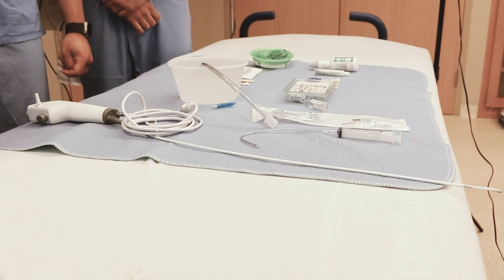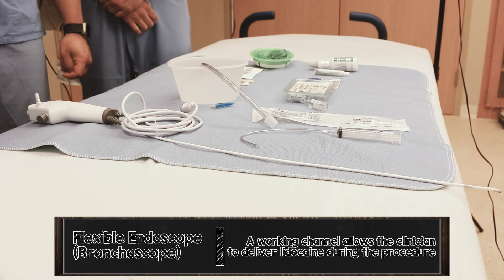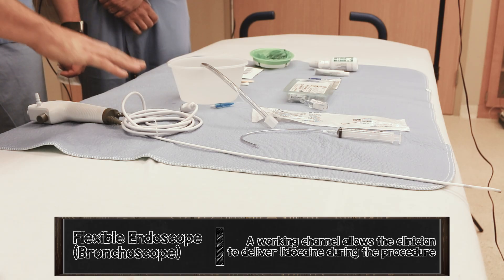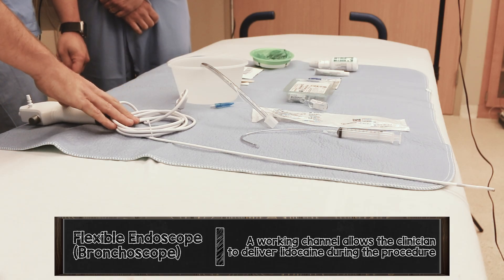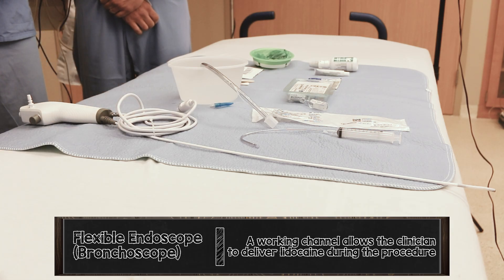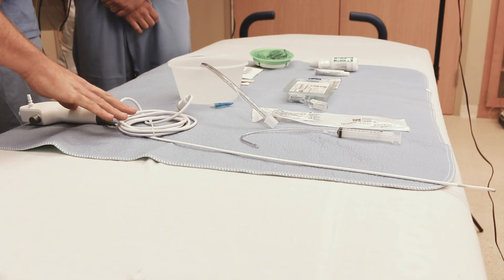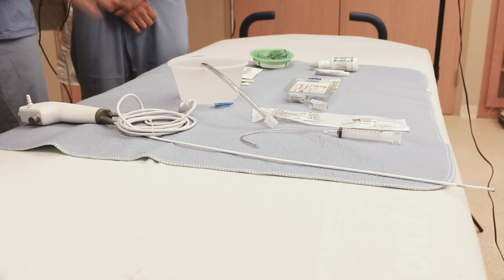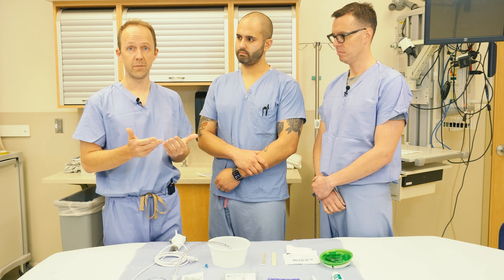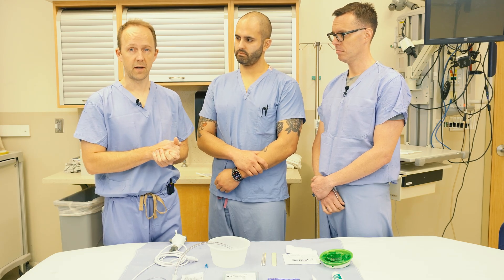Your choice of scope is also important. You want a scope with a working channel so you can apply lidocaine through it when hovering above the vocal cords. All the major companies that make video laryngoscopes make a disposable scope, so whatever system you have, you should be able to find one for emergency nasal intubation. The smaller the better — this one is 3.8 millimeter outer diameter. That smaller diameter fits through the tube easier, is more maneuverable, and you can still suction and apply lidocaine through the port.